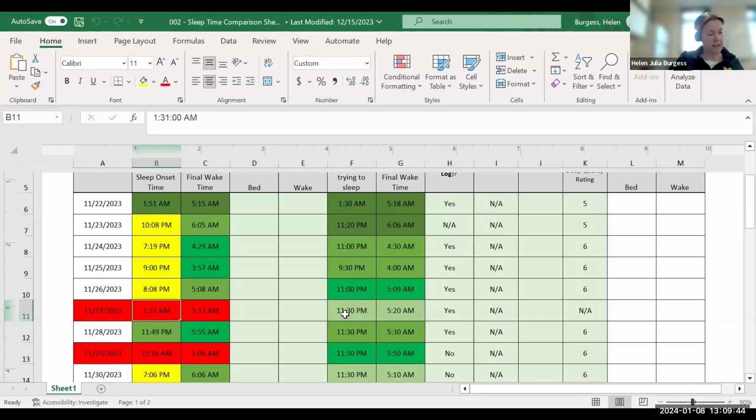And then I guess the last case, we haven't seen a lot of this in our testing, but certainly it seems possible that someone could report, for example, waking up at 6 and then they stay in bed and they're scrolling on their phone for half an hour or an hour. That is something that we would also double check. Look at the time that Fitbit is reporting they woke up, cross-checking that against the sleep diary, and then asking the subject if there's anything unusual that happened that morning. So yeah, this is where we collate all the data and start to get a sense of what's happening.